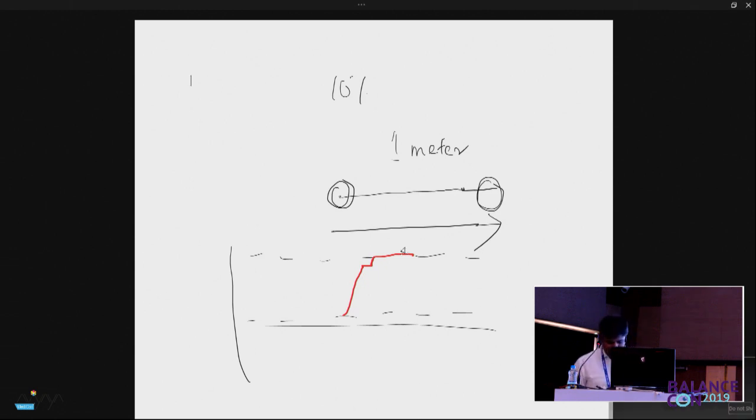But when we see the videonystagmography studies of several patients, you will see that this finding of a little bit of hypometria is normal for a lot of people. Then how do you say whether it is a real hypometria because of real underestimation of distances? Let us go back to this one.